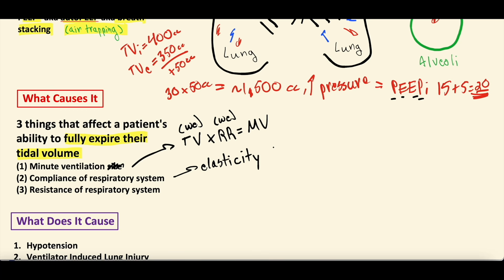The mathematical equation, if you're interested, is change in volume over change in pressure. Not super important for the sake of this lecture. We're not going to dive into this concept in any amount of detail. But you can picture that if the lungs are more or less elastic, they're going to be able to push out that air either faster or slower, right?